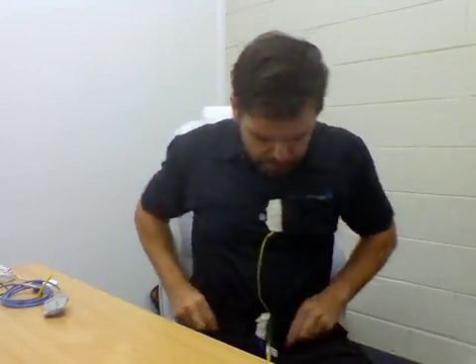Now these bands here measure your respiratory effort, so your thoracic and abdomen effort. As you're breathing in and out, there's a sensor in this band that expands and contracts, so we get a nice breathing signal from the bands there. And they're useful because they help us determine if you have what we call central apnea. I won't go into the details, but they also let us know about your breathing effort as well.